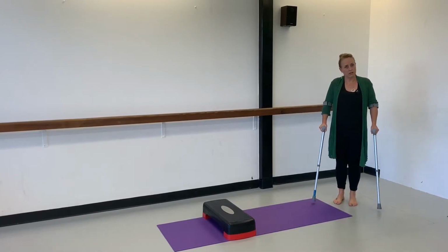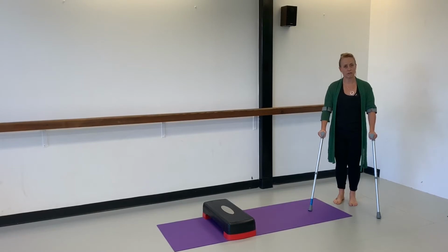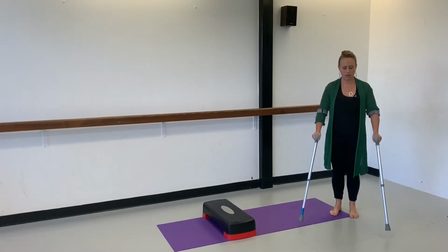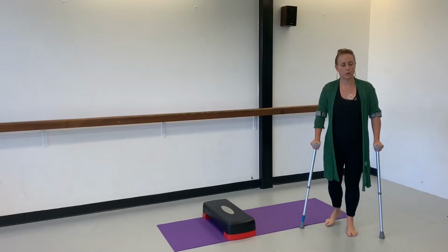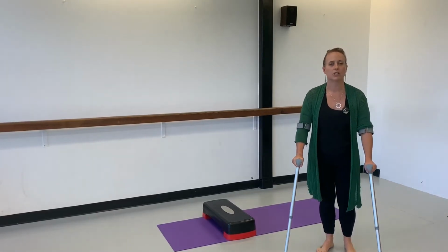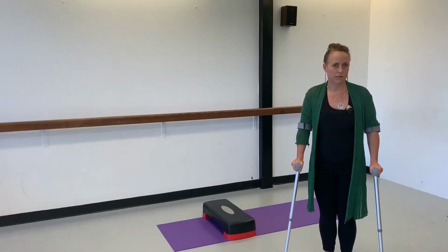So when you start on 2 crutches, you'll have your crutches, take them forward, then your sore leg, and then your good leg. Crutches, sore leg, good leg. You'll start like that in the first few days after your surgery, just nice, comfortable steps.